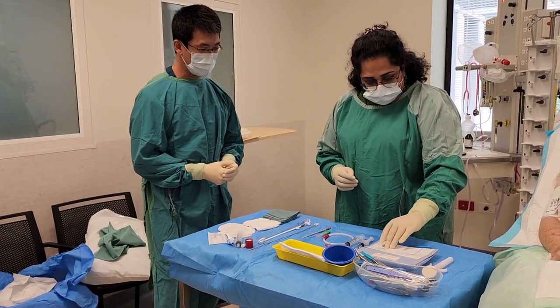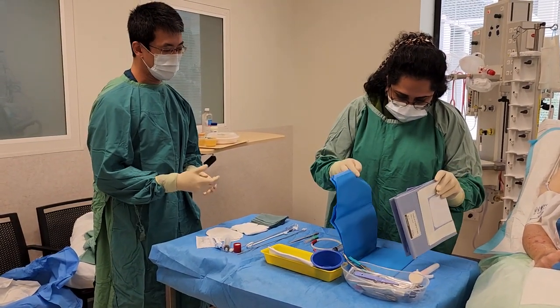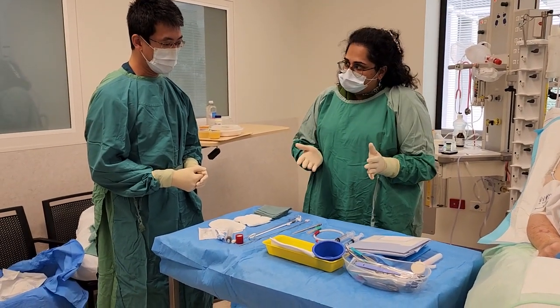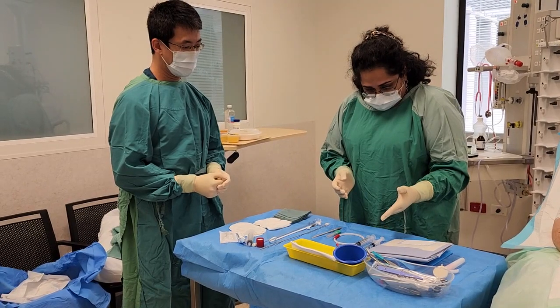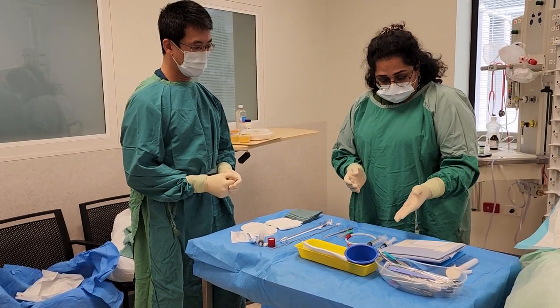I've got a fenestrated drape for the window. I'm not sure what this one is. That's just a drape. And then after I put the drape on to isolate the area that I will be using to insert the chest drain, I have a 5 ml syringe with some 1% lidocaine for local anesthetic.